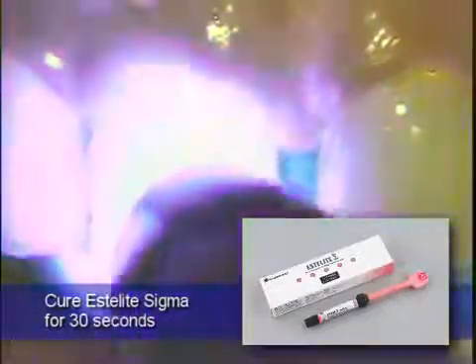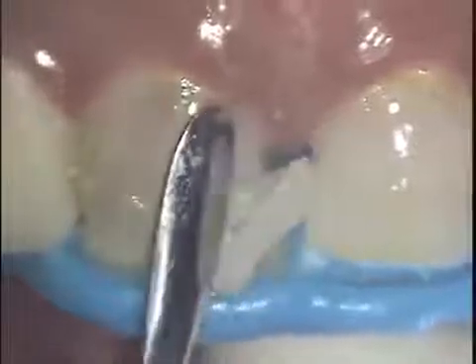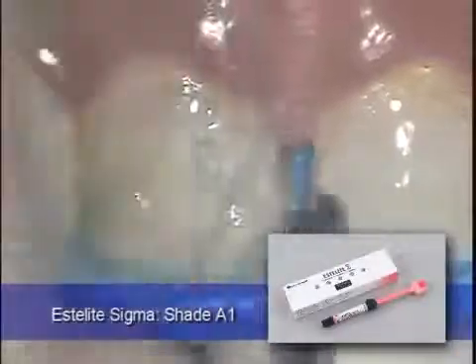Estelite Sigma is cured for 30 seconds, followed by the placement of additional Estelite Sigma to close the midline diastema.